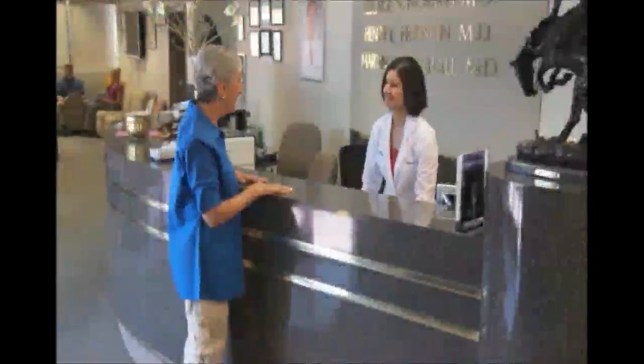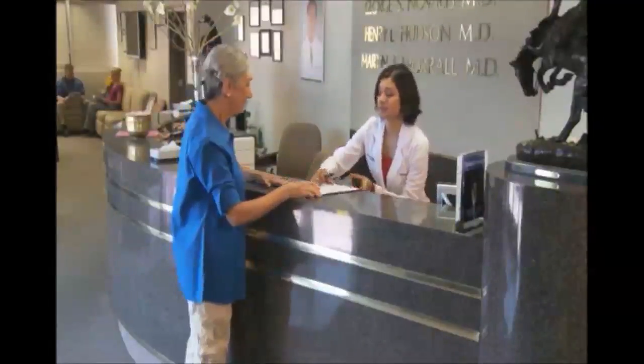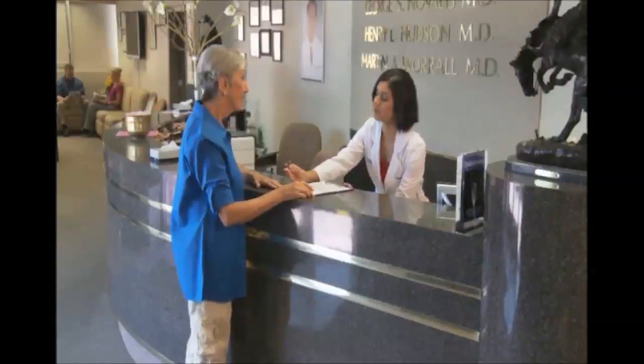This video will demonstrate the steps that a retinal surgeon or other health care professional should follow in order to administer Visudyne therapy.